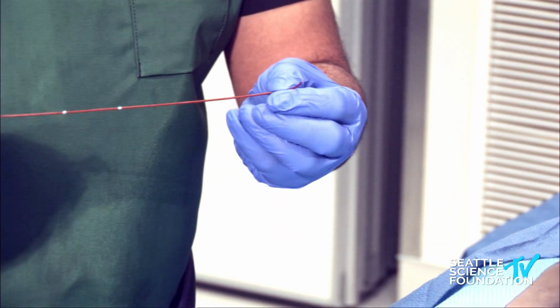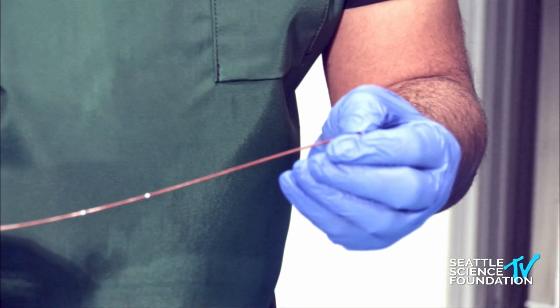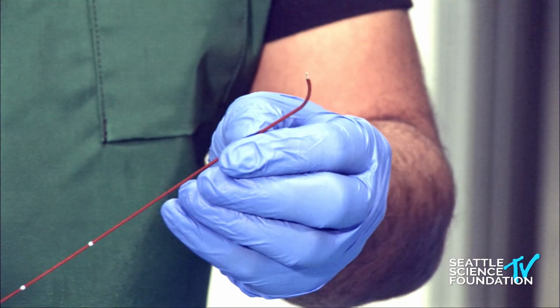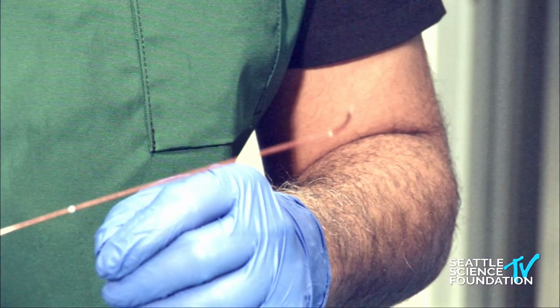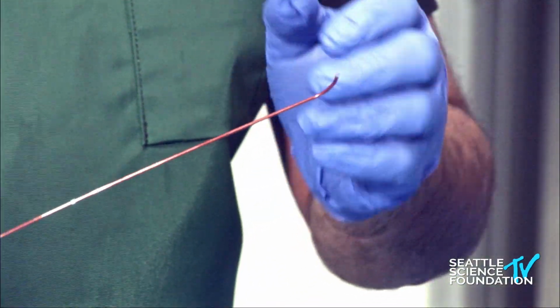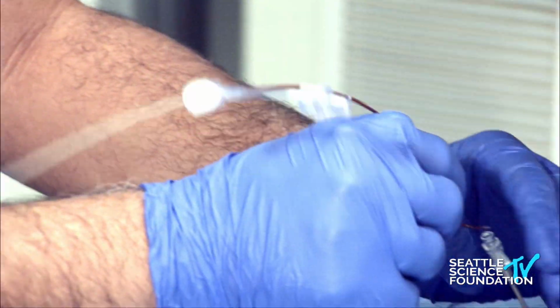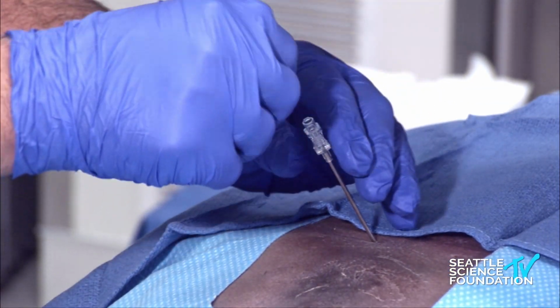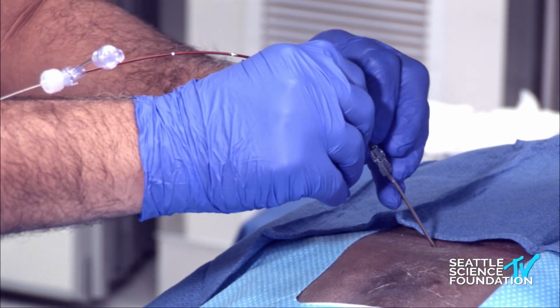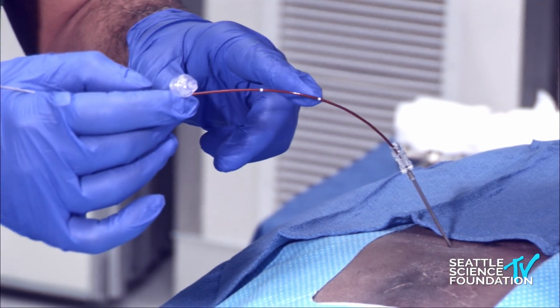The key here is to remember that when you put the guide wire in there, the guide wire protrudes out, if you guys can see here, about 1 or 2 millimeters beyond the curvature of the sheath. The sheath is curved for a reason, because as you follow the straight trajectory and reach the doorsteps of the foramen, it takes a parabolic curve into the foramen where your DRG is parked. So you basically stabilize your needle, hold the sheath at the tip, and go ahead.